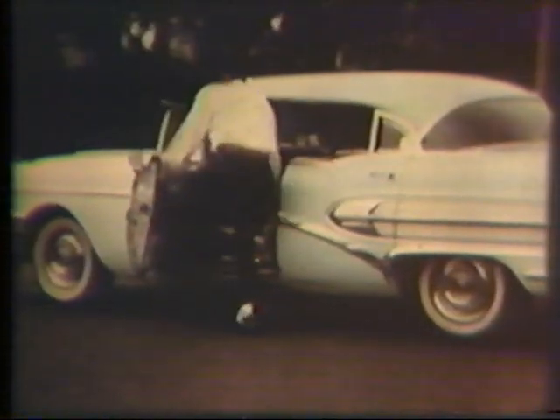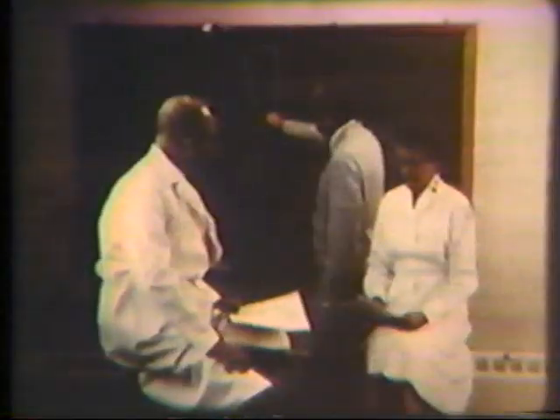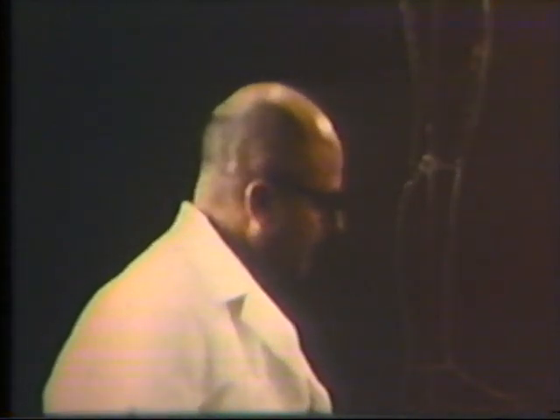Both normal gait and common gait deviations of the above-knee amputee will be described in this film. The amputee is Mr. William Sobey. The clinic team members commenting in this film include Dr. Frederick Volte, chairman of the Department of Physical Medicine and Rehabilitation of the Medical College of Virginia.